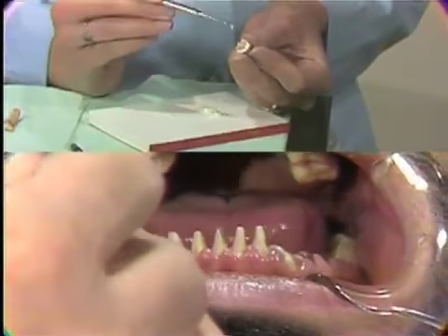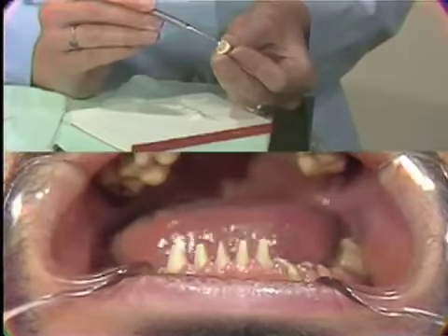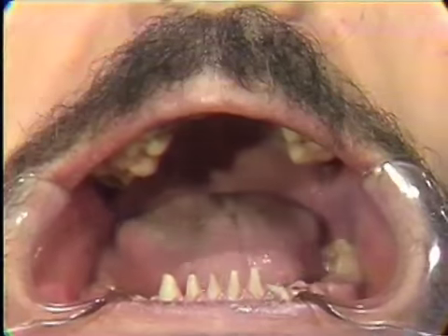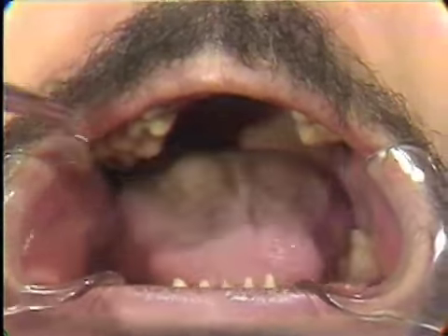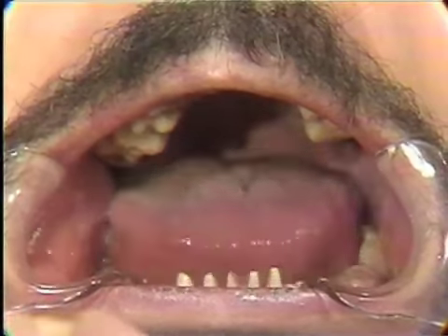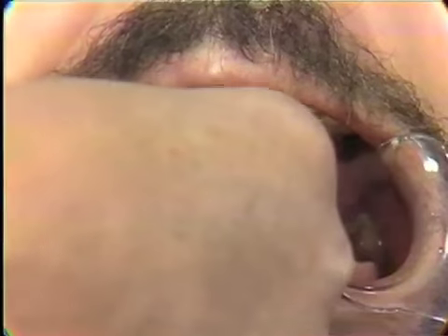Enough to seal it in place while the assistant is loading the temporary. You can be drying out the mouth. The tooth doesn't have to be absolutely dry, just relatively free of moisture. Put the temporary in place.